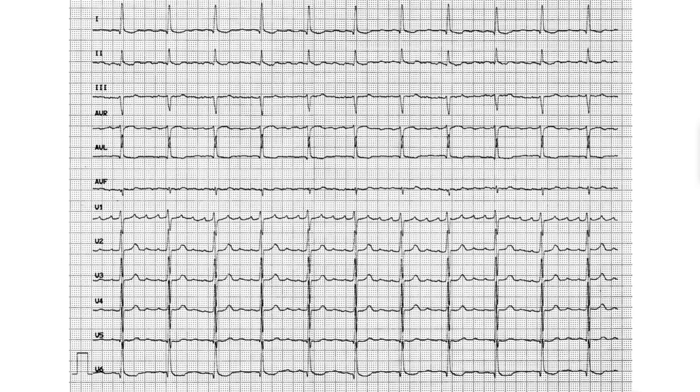I'm sorry, I keep forgetting. The previous one was 20. The previous one was 23. This one is 24. Hopefully, I'll remember to say these beforehand. So this is question 24.